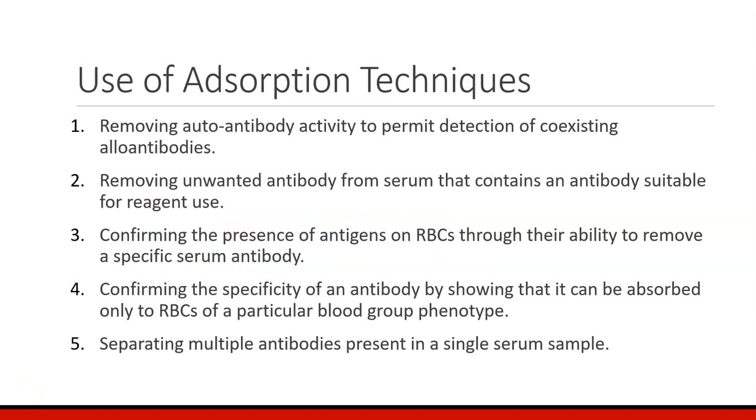I want you to memorize the 5 uses of adsorption techniques. 1, removing autoantibody activity to permit detection of coexisting alloantibodies. So that's the example I just showed you in the previous slide.